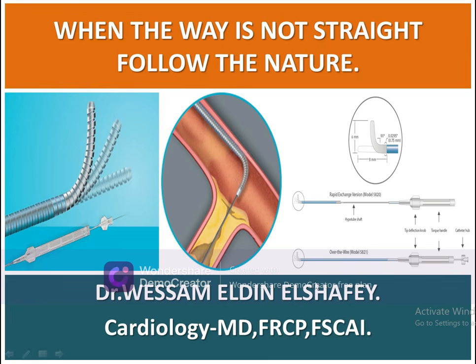Bismillahirrahmanirrahim. Today we will demonstrate a case of chronic total occlusion, CTO, of CIRC OM. This case was very tough and very difficult, and I think it follows a lot of tips and tricks, and we will try to demonstrate it exactly here. I named this case under the title of When the Way is Not Straight, So Follows the Nature.